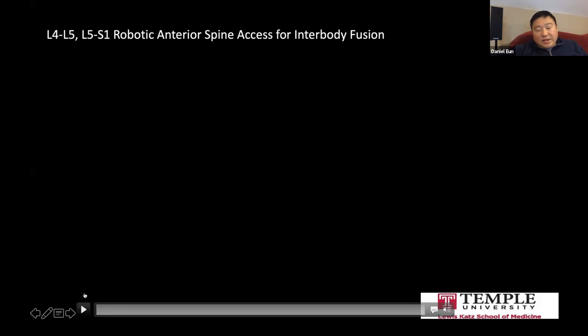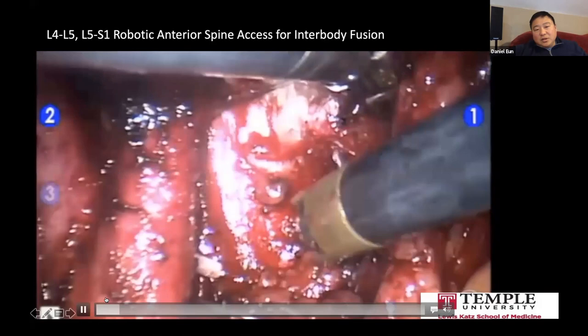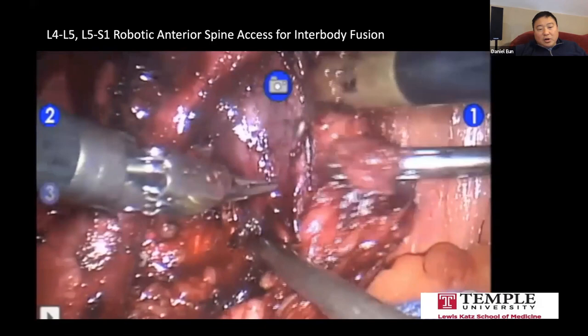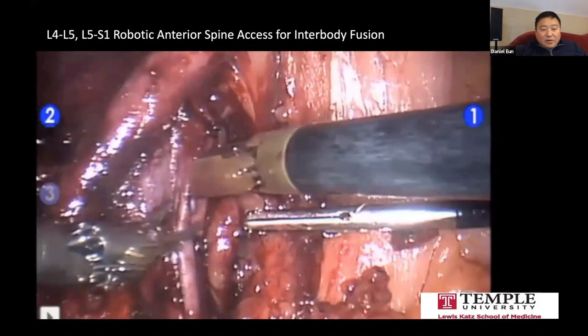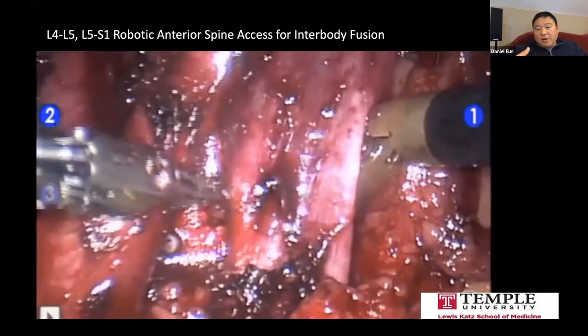Back in the earliest part of my career, when I worked for the University of Pennsylvania, I was approached by the spine surgeons to do spine interbody fusion and give them access robotically. Here's an example of what this procedure looked like. Here we're splitting the aorta and cava, that's the anterior spinal ligament, and we're going to put drilling hardware into the inner space. We co-docked a robot and a C-arm together. Here I'm lifting up the vena cava. We put clips on the lumbar vessels of the IVC and of the aorta to literally split above them. This is an L4, L5, L5-S1, double level spinal fusion.